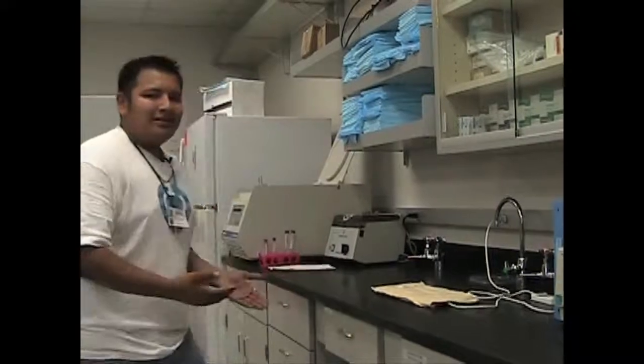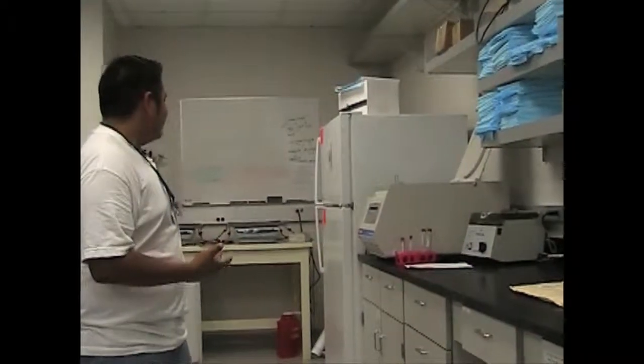It takes them one to two minutes to recover from here. It just depends on where we want them—either put them on the shaker or let them shake for at least a couple of days. It just depends on what we want here in the lab. This is the lab that I work at.